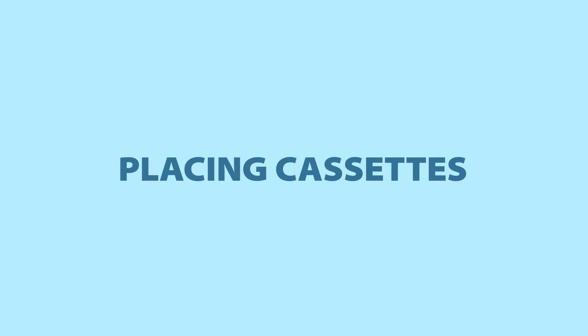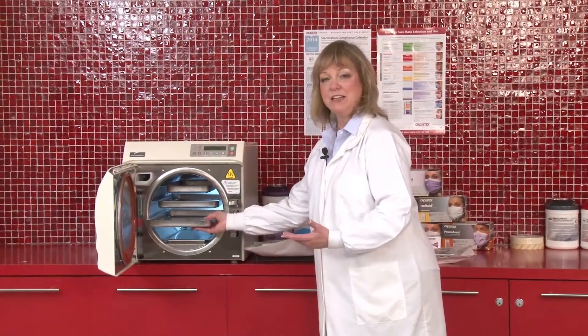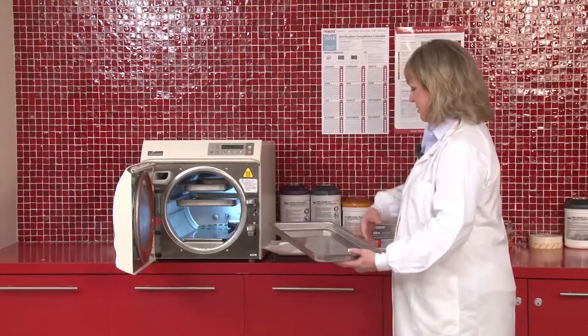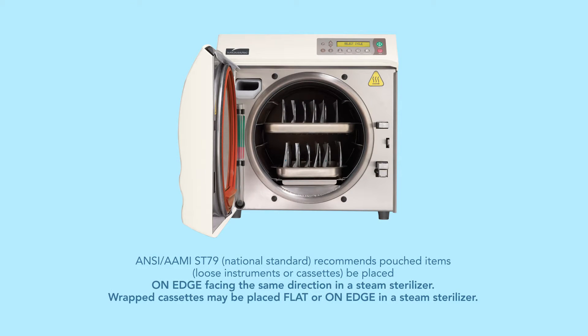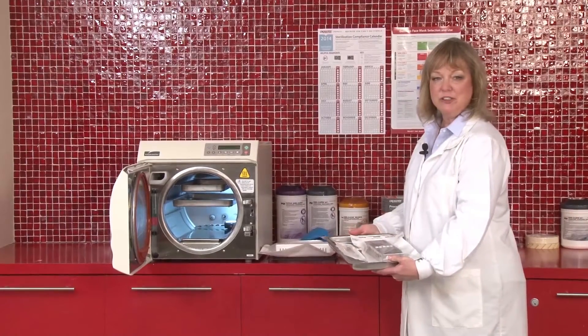The other option I want to show you is that if you're using cassettes, again I'm taking the tray out simply for demonstration purposes. If you're going to use a cassette, it may take up the entire space. Or if you have a single instrument, you may be able to put a single instrument aside.